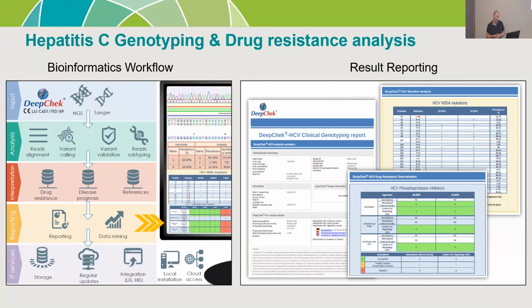So at the moment we're starting off small with hepatitis C, but moving forward, our immunology department, which looks at HIV, is definitely very interested in these types of assays, and probably hepatitis B and maybe some of the herpes viruses, similar sorts of things that we can apply this technology to.